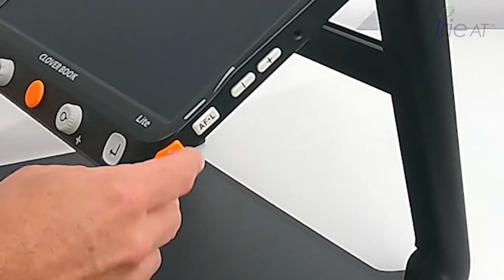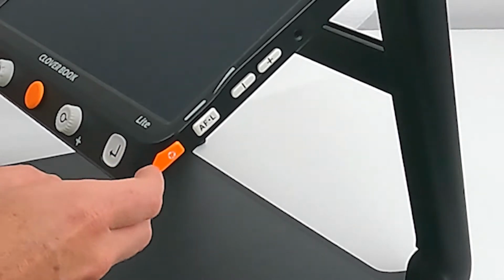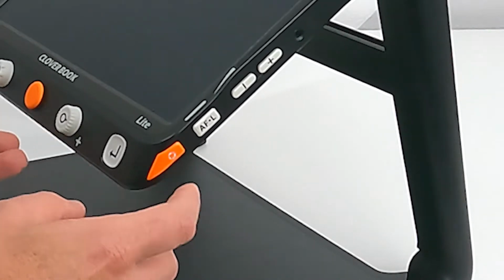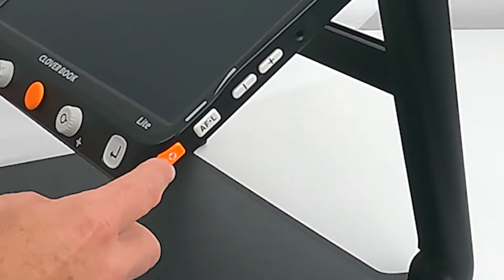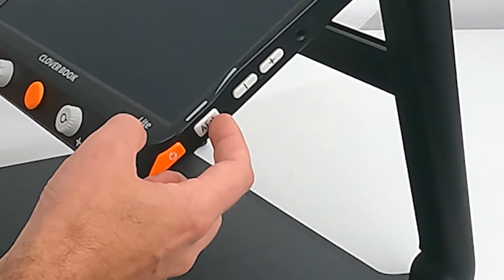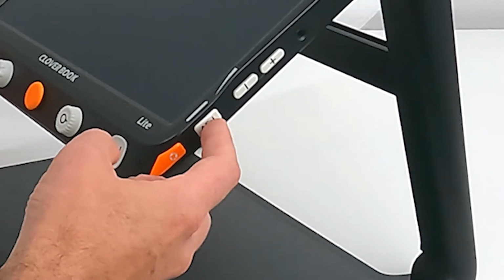I'm going to turn it around to the right side of the screen. We've got another button right on the corner, kind of an odd shaped button like the lines and blinds, only this one's orange with a circular white icon on it. And that's going to be your save and still picture. You press it once and you'll get still, you hold it and you'll save pictures, but I'll show you how that works. Then going up the right hand side from bottom to top, we have a rectangular white button, says AFL on it. That's your autofocus lock.